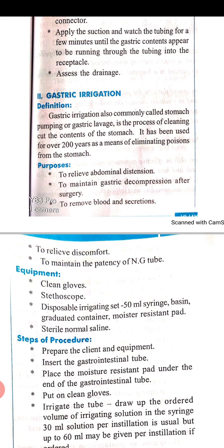Gastric irrigation is a procedure by which the stomach content will be cleaned. Gastric irrigation is a process of cleaning the content of the stomach.